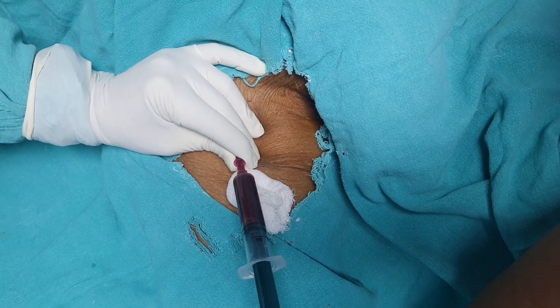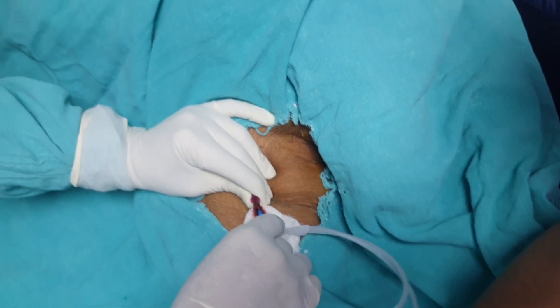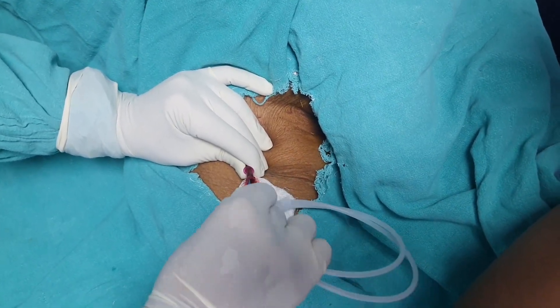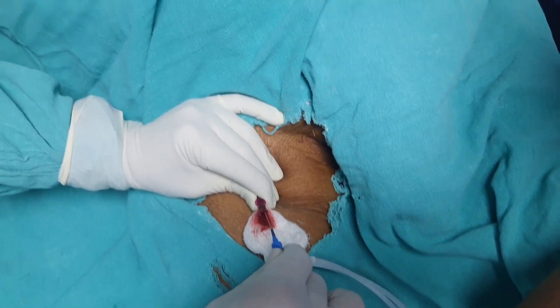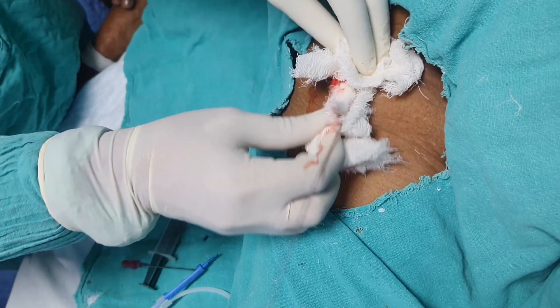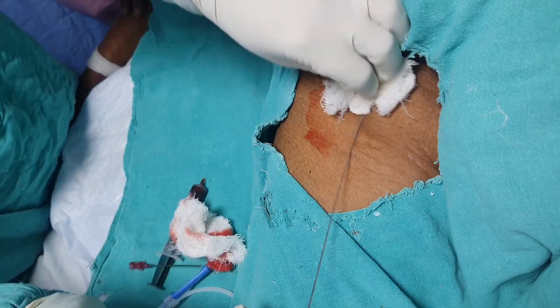Now we will insert the guide wire. We have to insert gently — we should not use force. Otherwise it can rupture the posterior wall of the femoral vein.